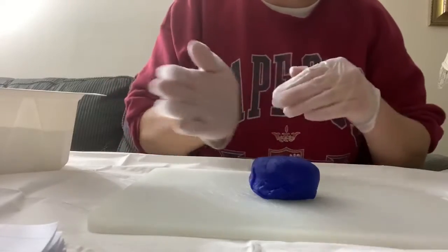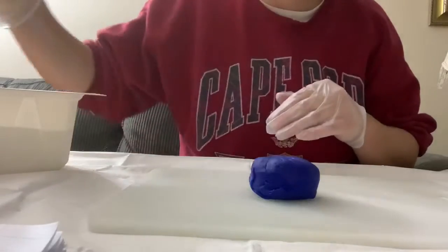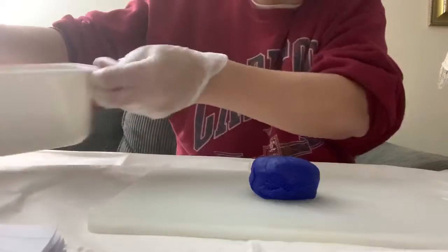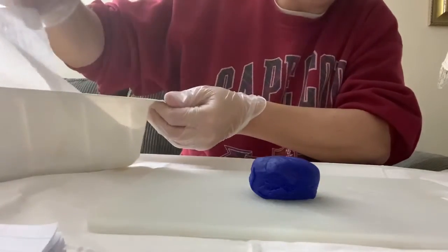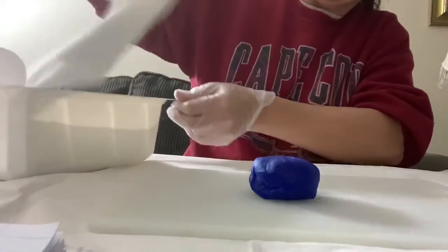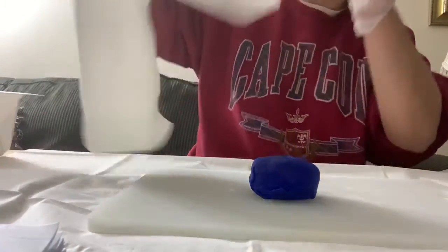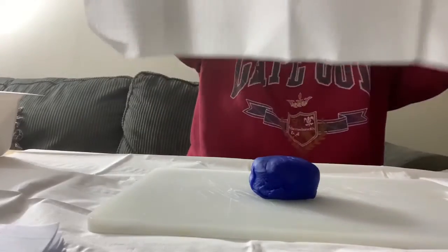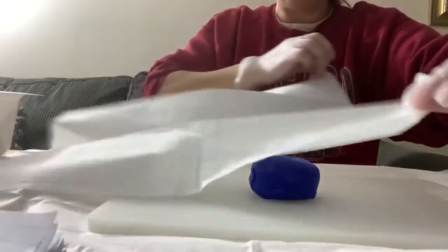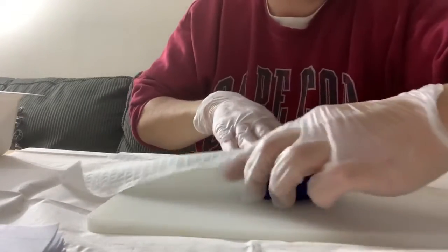I'm right-handed, so I'm going to work on the patient's right-hand side. The first thing I'm going to do is grab this drape out of my kit by the corners. I'm just going to pick it up and shake it out. And it's going to go shiny side down, and I'm just going to place this underneath the patient.